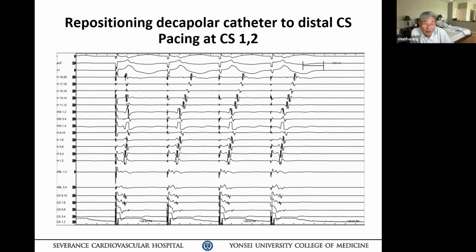So you can tell your activation sequence at this point, V and A clearly, but I think the output is too high, distal and proximal. I mean, 3, 4 is pretty much a saturated signal. So you don't need to pace at that high an output because you got a beautiful location. Okay.